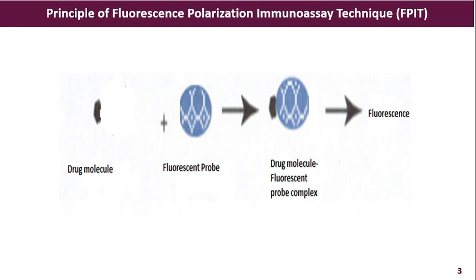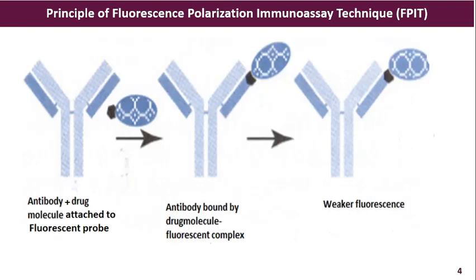The fluorescence of the sample will resemble the fluorescence of the original drug molecule fluorescent probe complex. Whereas if the drug molecules are not present in the sample, then the drug molecule fluorescent complex will engage the FAB sites of the antibody.